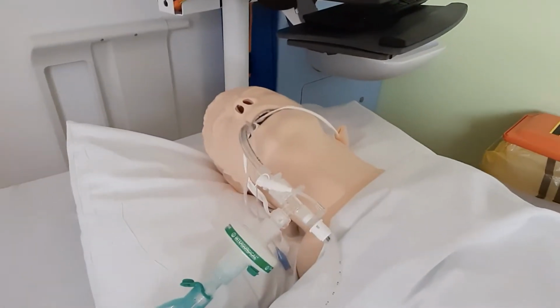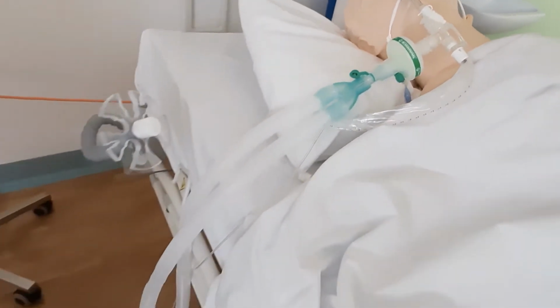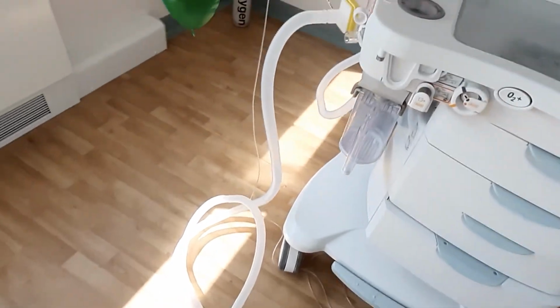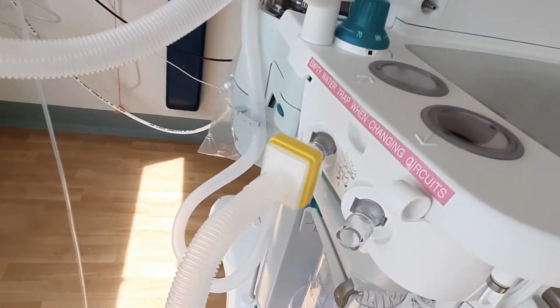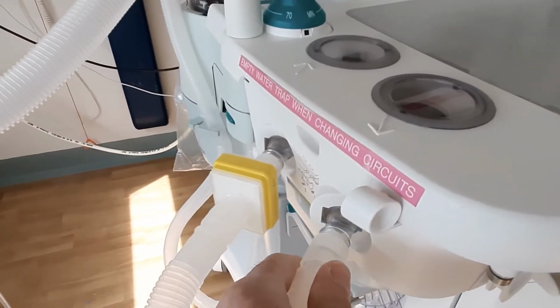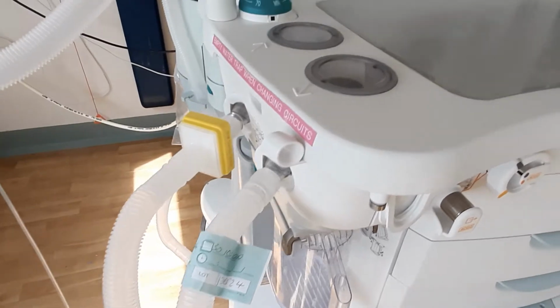First, check the patient and then follow the circuit towards the anaesthetic machine. Look for any disconnection. Here is a disconnection on the inspiratory port which would cause a massive leak. Reconnect and watch the bellows gradually re-inflate.